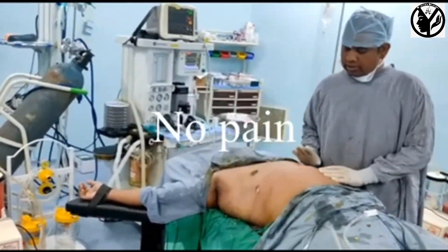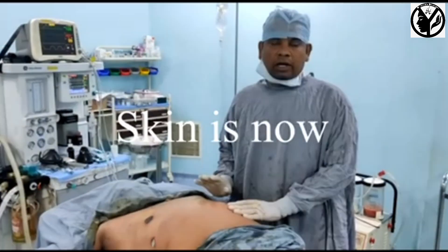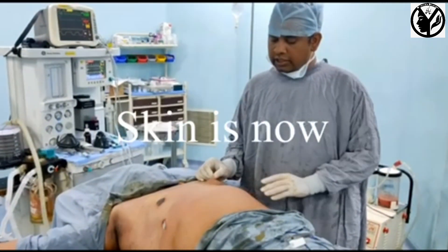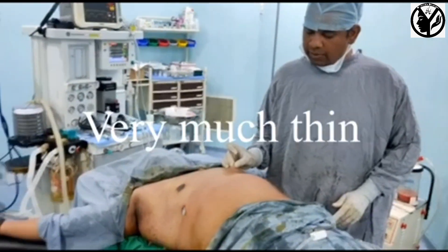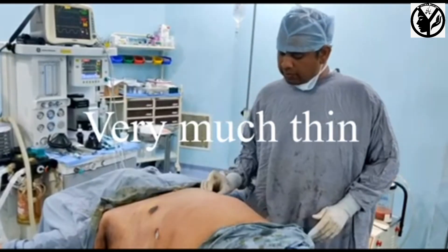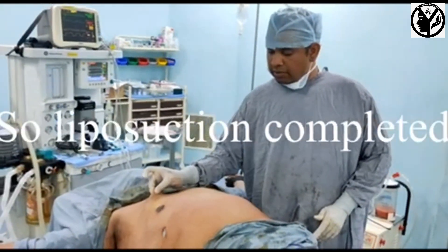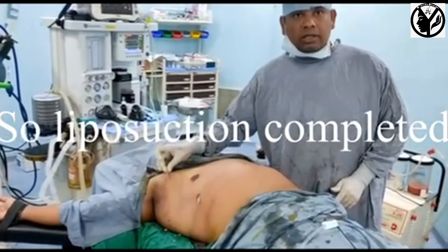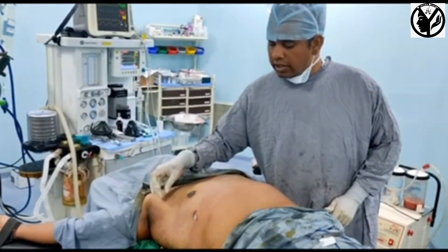The liposuction has to be tested. End points have to be assessed with the skin. This is the end point — the liposuction end point.